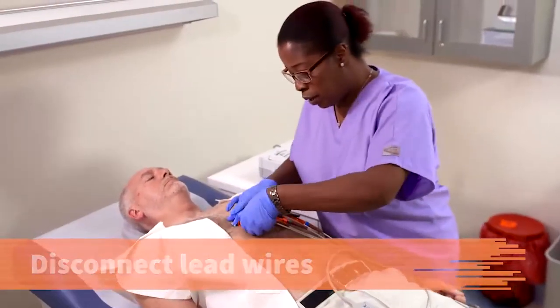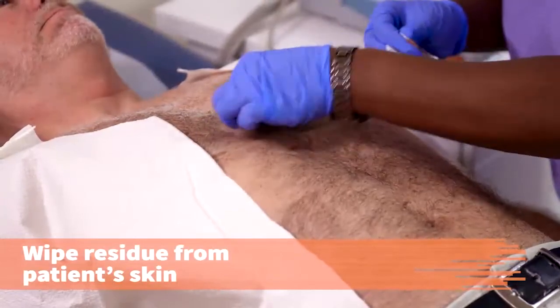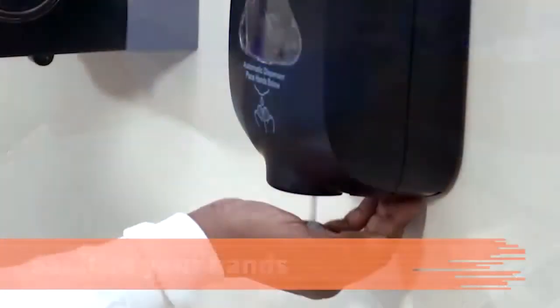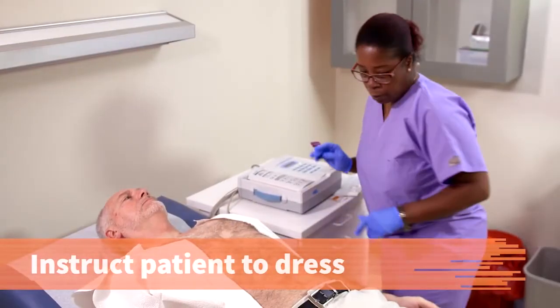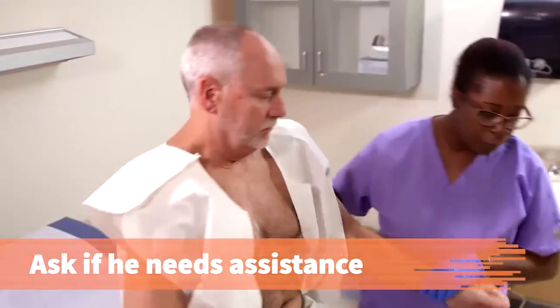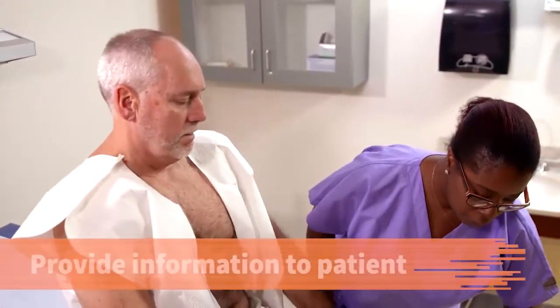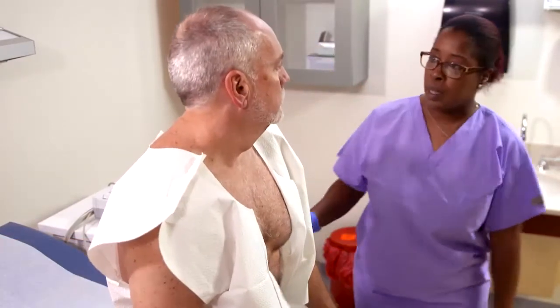Disconnect the lead wires and remove the electrodes. Clean any residue from the patient's skin with an alcohol wipe, and sanitize your hands. Instruct the patient to get dressed. Ask the patient if he needs assistance — if so, assist him in dressing. Provide the patient with information about following up with the provider. Then you can go ahead and get dressed.